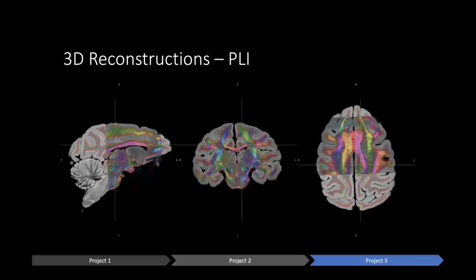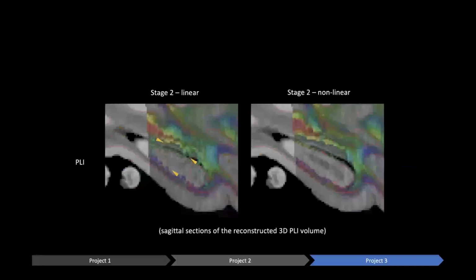Yes, so there are limitations of what my deformation model can achieve at this point. I'm always aiming to constrain my deformations so that they are all diffeomorphic, so the Jacobian determinants never fall under 0.